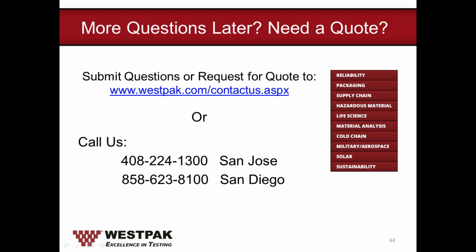It doesn't mean that you fail sterile barrier testing if that's your key focus. So it is how much risk you're willing to take in not being able to reach the calculated top load, but a lot of our medical device customers love to have that compression be a pass so they won't run into any issues. Thanks, Greg.